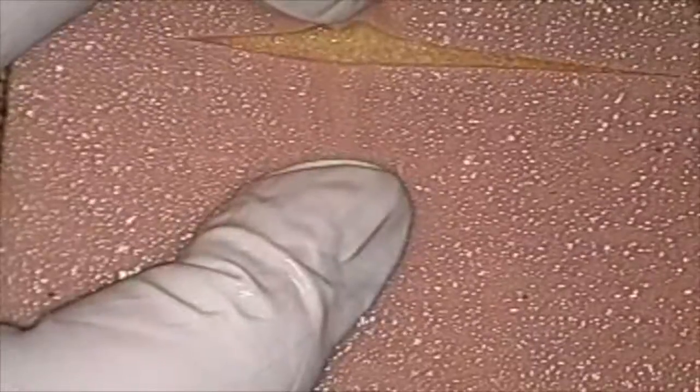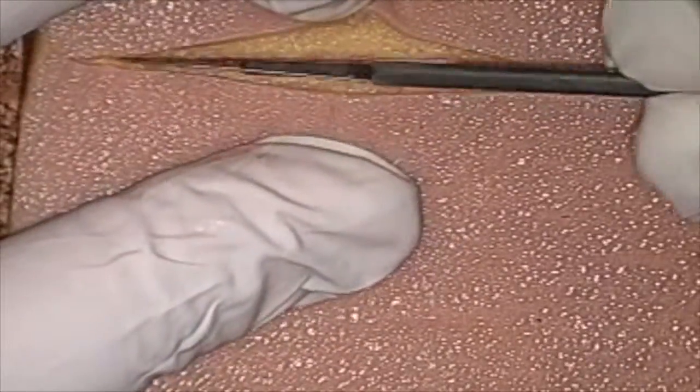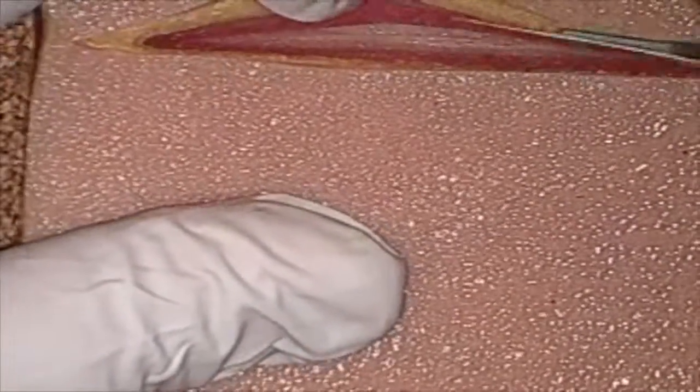If you get down to that red layer, that would be more similar to your linea. These yellow layers would be more resembling your subcutaneous or subcuticular tissue that you want to work on. Make sure it's a nice long incision. As you can see here, you have to actually spread the tissue with your fingers to get down and visualize those deeper layers.